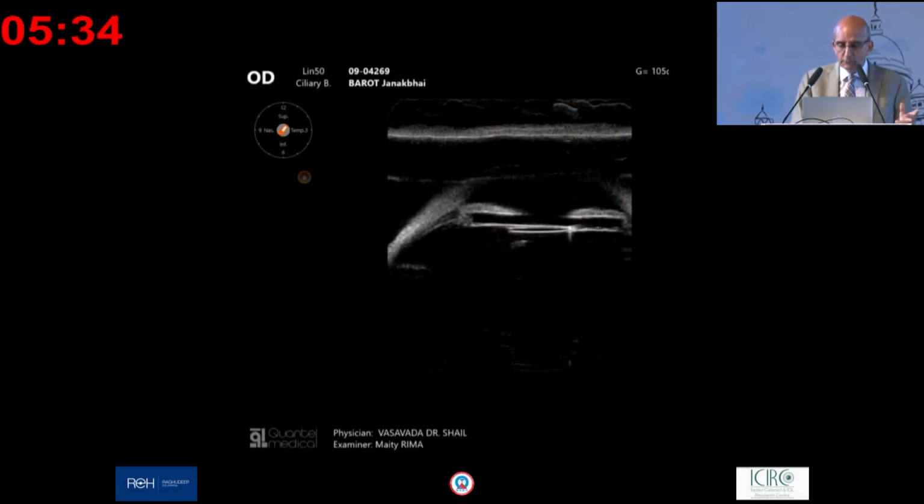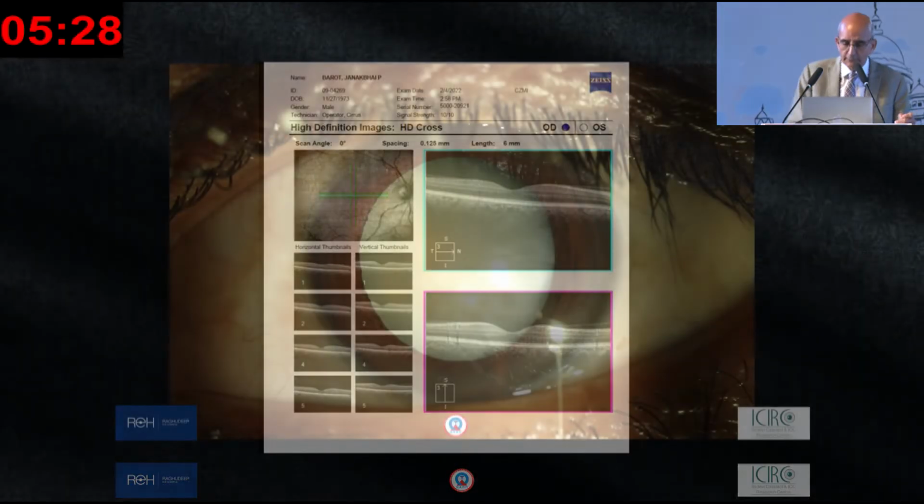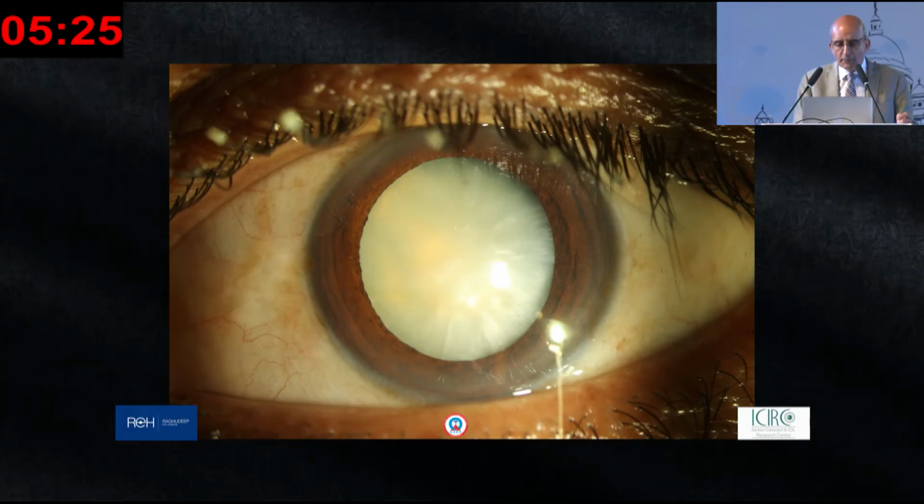And if you monitor with the UBM, with the retinal colleagues, not only the macula but peripheral retina, it's very critical that we do that. Quite often, in this modern time for the last few years, we have a retinal colleague working with it, and you would be very happy, Dr. Dadani, that your role has always been there, but much more now. So we warn him, and he's around. He's downstairs on the other floor, and he said, I'll come up any time. So we really co-manage it. But this is something I could do, but I would recommend, if you have a posterior polar and particular things like this, always keep the retinal colleagues there.